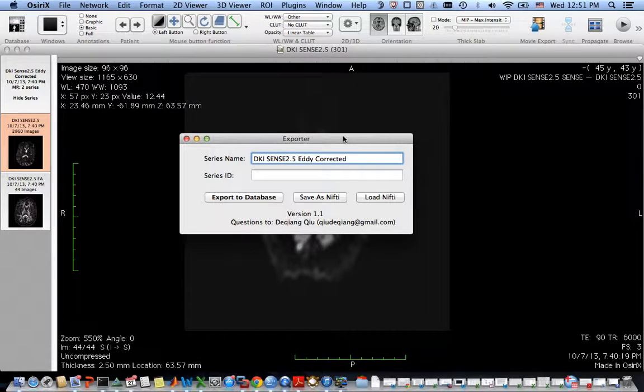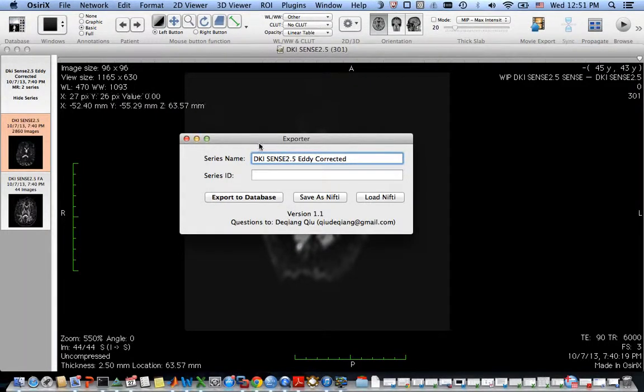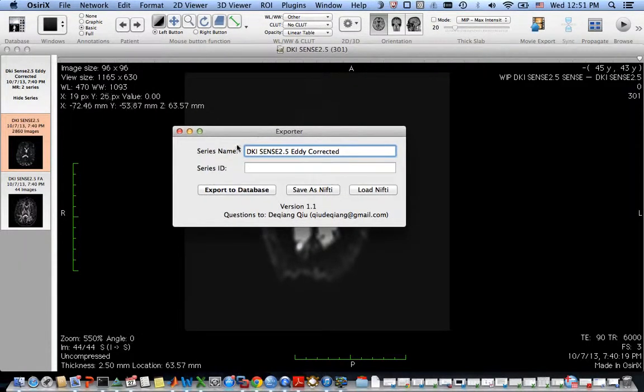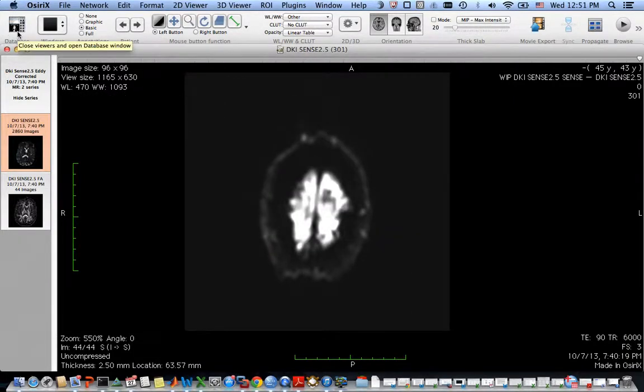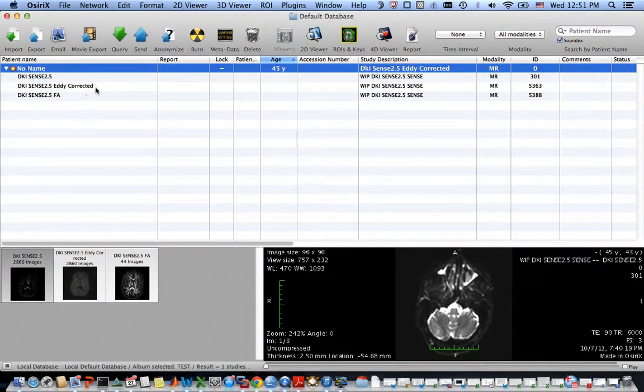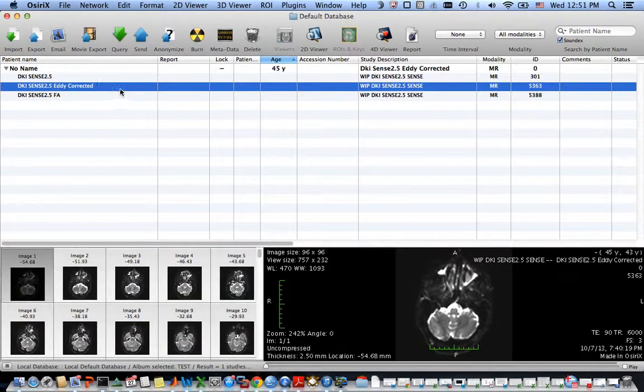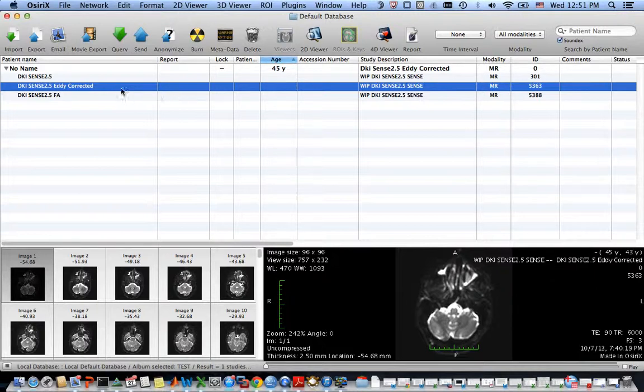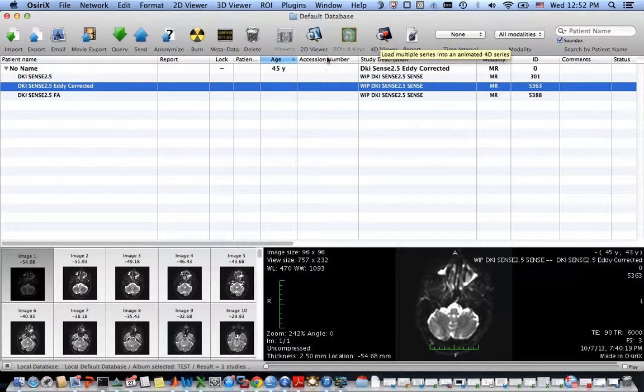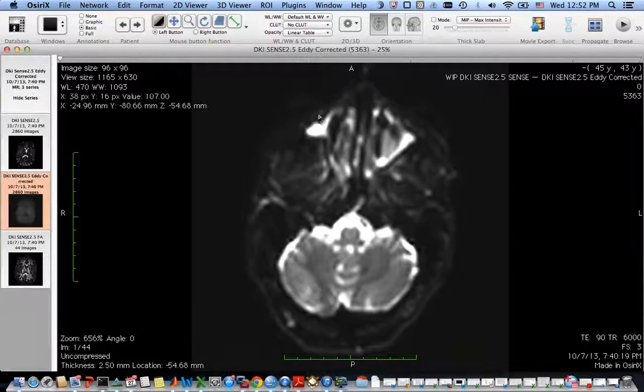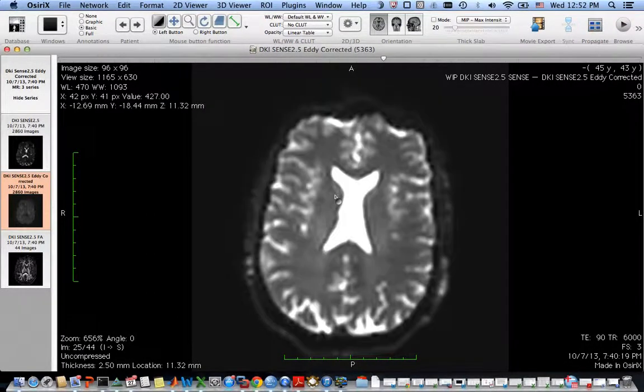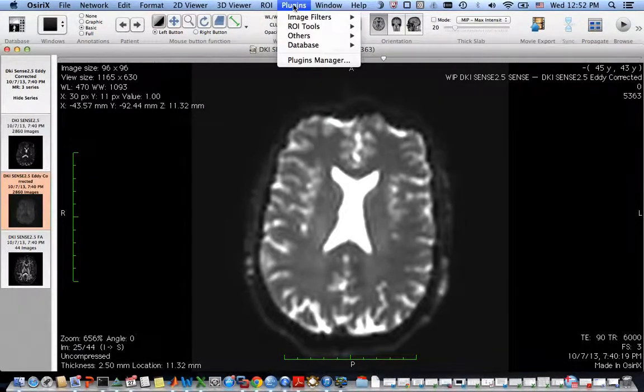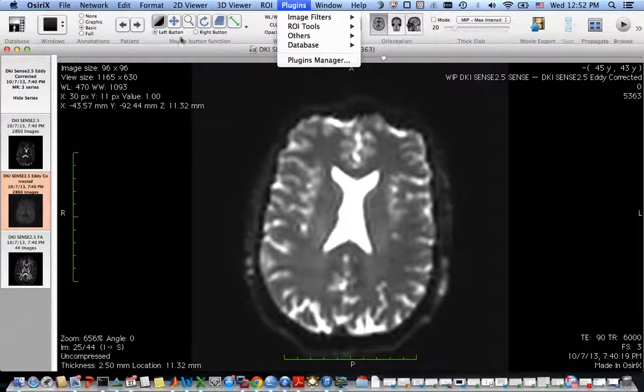In order to do that, you have to use the other plugin that I'm going to demo very shortly after this. So now the exporting has finished. Let's go check that. You can see indeed the eddy corrected images are imported to Osiris database. Now you can open it using 4D viewer and typically I will use the DTI map plugin to calculate all the images here.